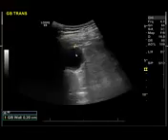You can see that this is the gallbladder here, so no sound was attenuated at this level because this is a fluid compartment without many interfaces. But beyond the gallbladder, you see nice acoustic enhancement. That tells you this is a poor attenuator. So fluid-containing areas or very smooth, soft tissue masses can transmit sound without attenuation, so you get acoustic enhancement.